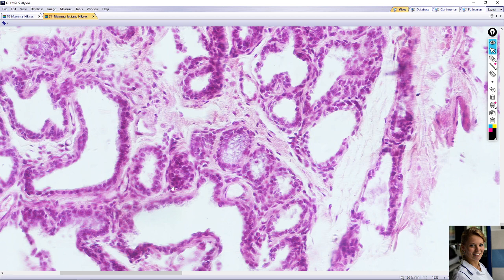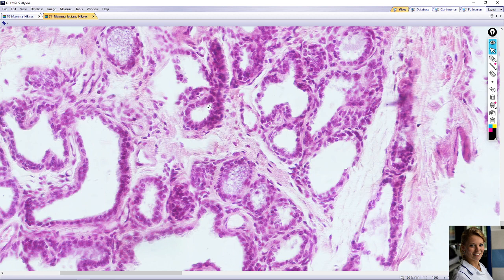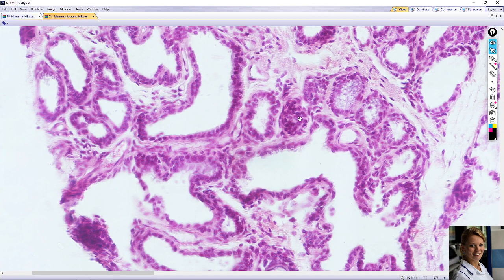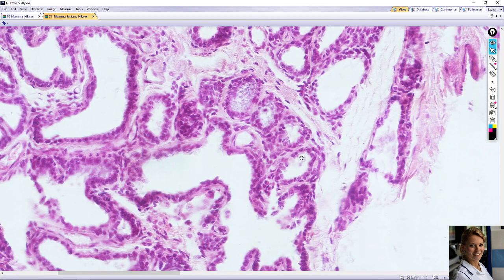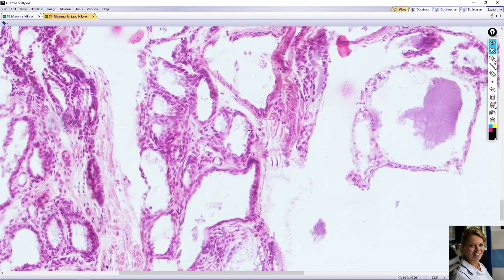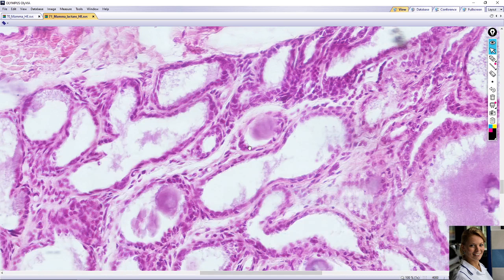Other alveoli appear inactive with empty lumina lined with columnar epithelium, for example here. Surrounding the alveoli are the myoepithelial cells and their basal lamina, for example here. You can see nuclei of the myoepithelial cells here. Contraction of the myoepithelial cells expels the milk into the interlobular excretory ducts.